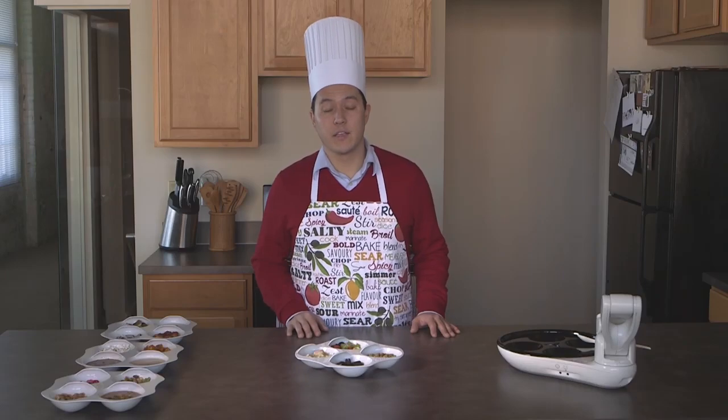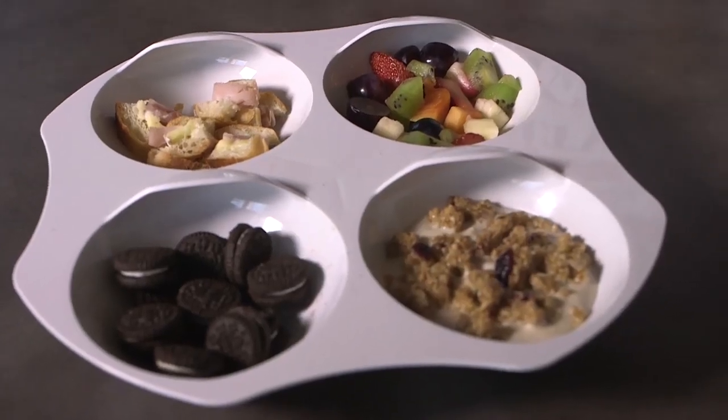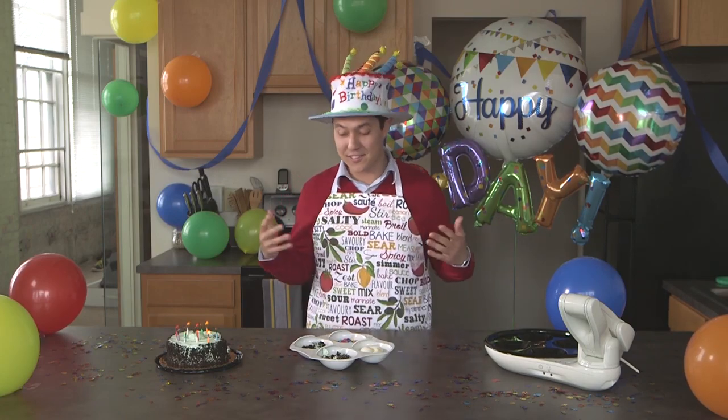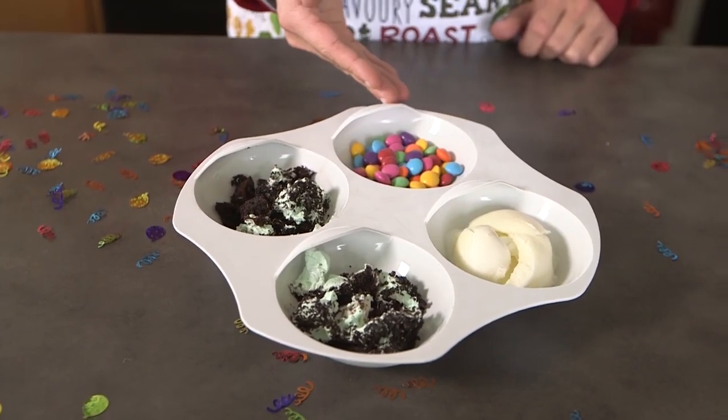The second meal we've prepared is a typical midday snack, complete with a sandwich, mini cookies, yogurt and granola, and fresh fruit cocktail. And now our favorite meal, the birthday celebration, with things like Andy's mint cake, fresh cream gelato, and candy coated chocolates.